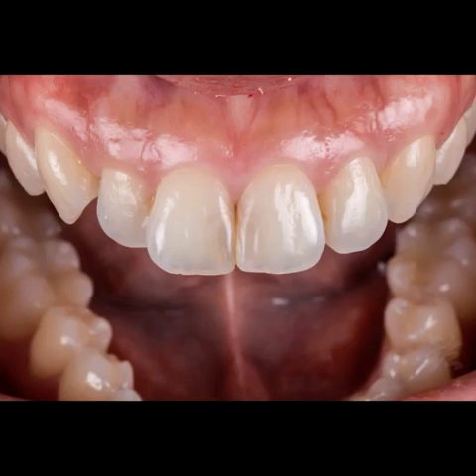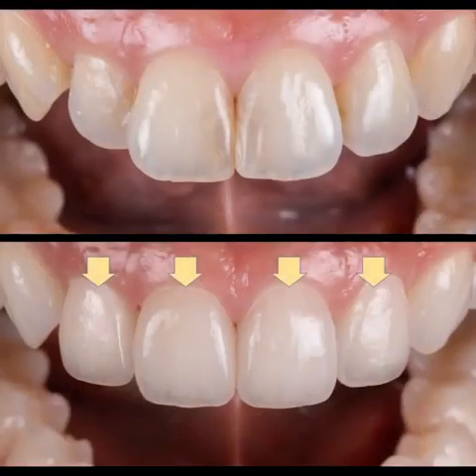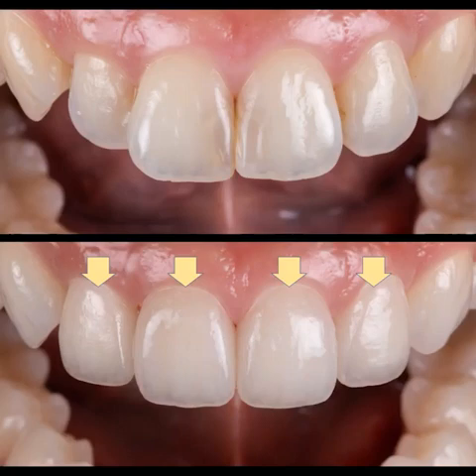Well, here is a patient with naturally translucent teeth, and it will take a considerable amount of staining, glazing, and firing to make a low translucency ceramic look like this. Sometimes it's simply impossible. As I begin my preparation, if I already know that I'll be using a high translucency ceramic, then I can adjust my preparation design to match the thickness needed by the ceramic and get realistic results without too much staining and glazing.